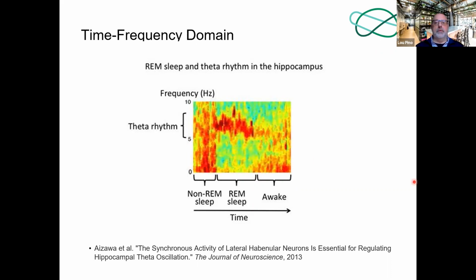Time frequency domain analysis of EEG has many advantages. It's closely related to the underlying neurophysiology of the brain. It allows for strict definitions of hypothesis testing, and the pretty colored plots allow for exploratory analysis and visualization.